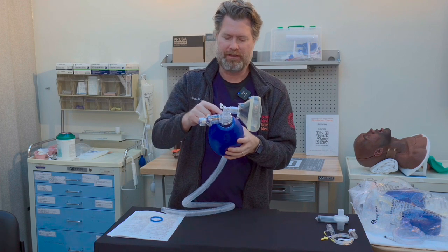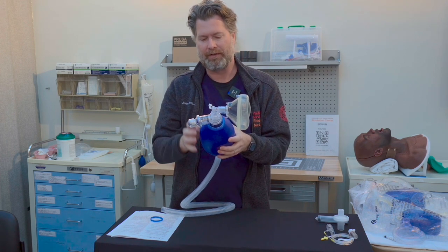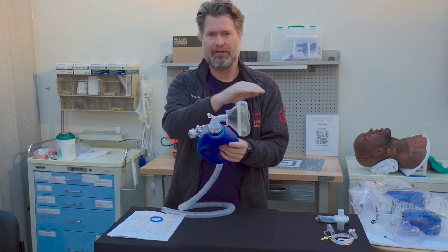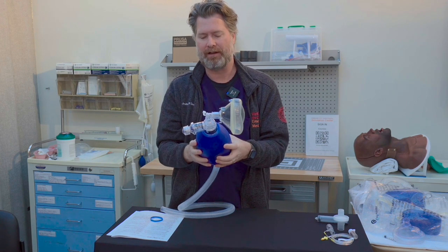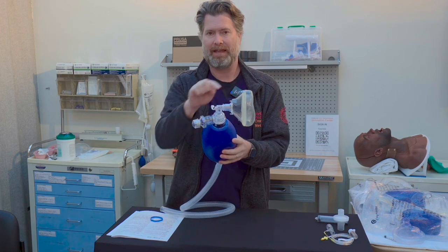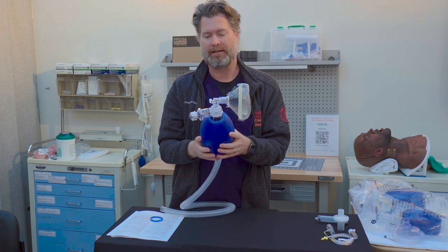Finally, you'll also see there's a one-way valve here — this is the non-rebreather valve. As you press, this opens and allows for all the entrainment of oxygen. But as you let go, nothing comes back, so the patient is not re-breathing their own carbon dioxide.